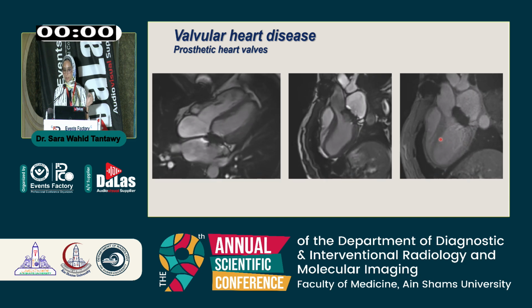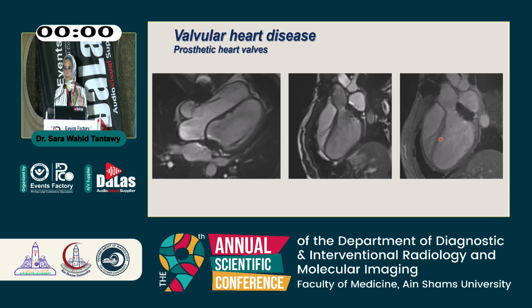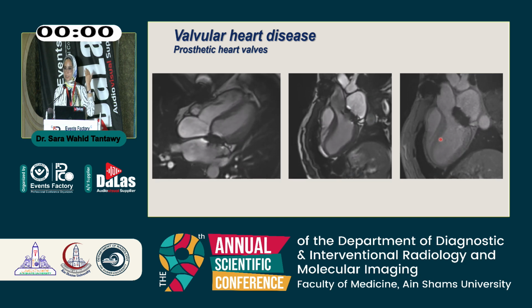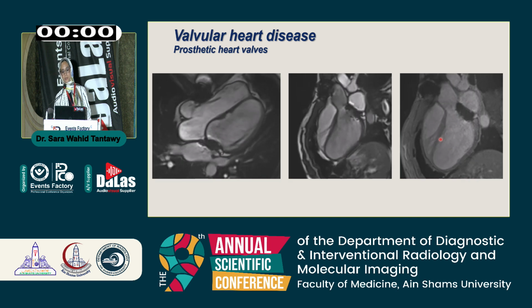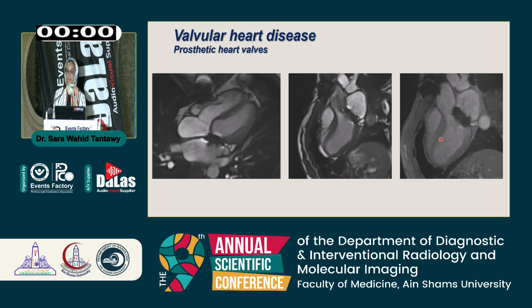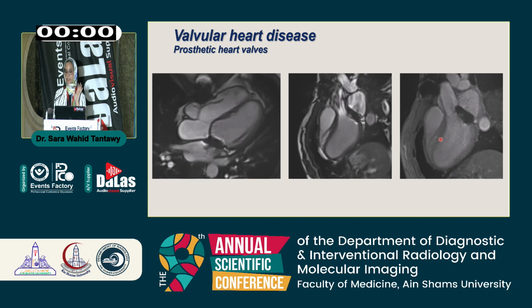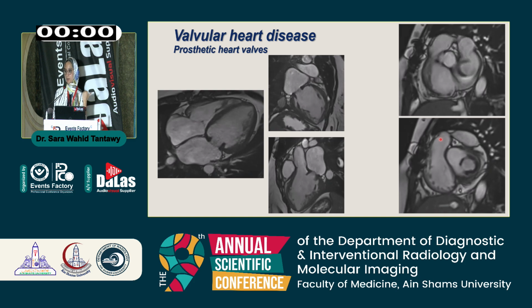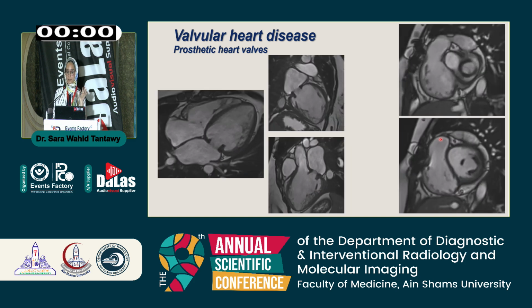Just a quick hint about the prosthetic heart valve. You can do CMR, 1.5 Tesla CMR on any type of the valve, except the ball and cage, which was used in very, very old eras in the valvular repair. You can otherwise do cardiac MRI patients safely as long as it's 1.5 Tesla. But you cannot, of course, see the direct mobility of the occluders in the metallic valves, but you can still quantify in the normal manner that we do.